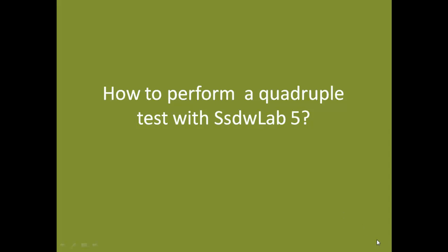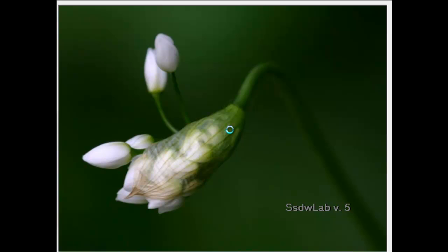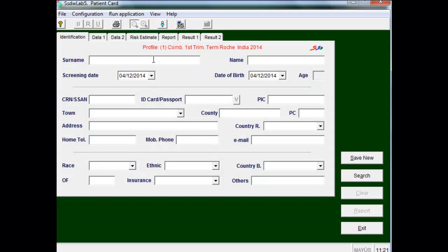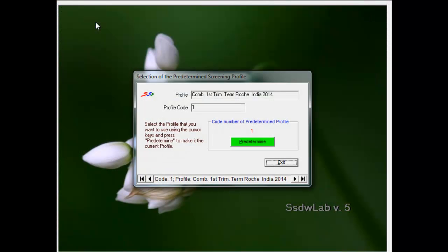Let's see how to perform a quadruple test with SSDW Lab 5. First, we introduce the username and password, and by default the profile of first trimester combined screening appears. We will have to exchange this profile for a quadruple test profile in this submenu, where we predetermine quadruple test profile, and then we exit to the data entry main screen.